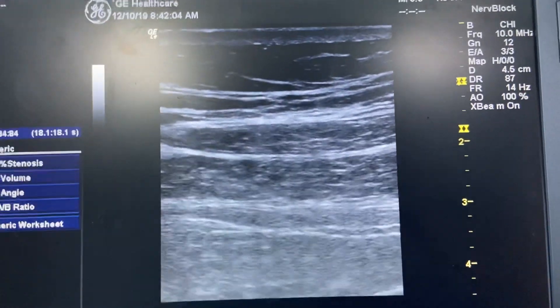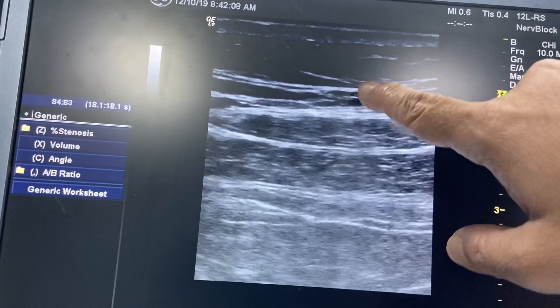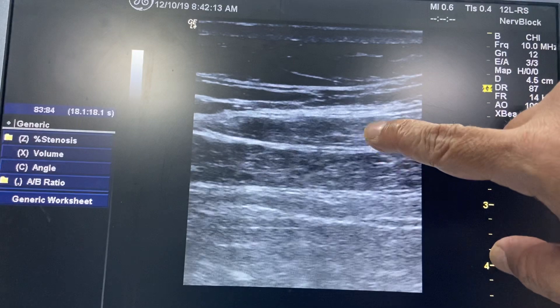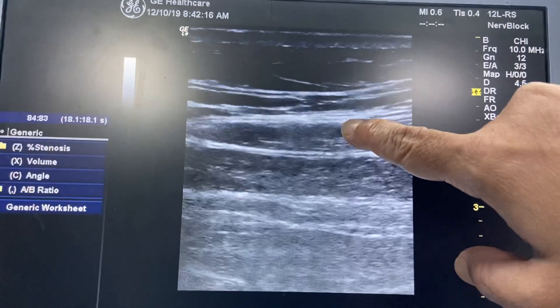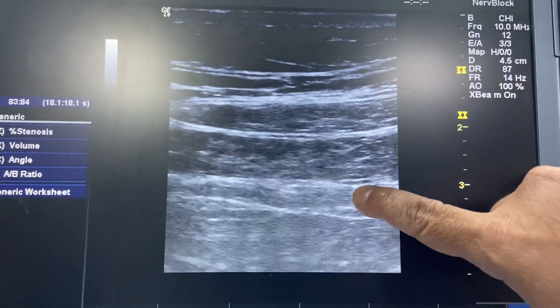These are the muscle layers. This is Camper's fascia — that is the subcutaneous tissue. This is Scarpa's fascia — that is the fibrous layer of the subcutaneous tissue. This is the external oblique muscle, this is the internal oblique muscle, and this is the transversus abdominis muscle.